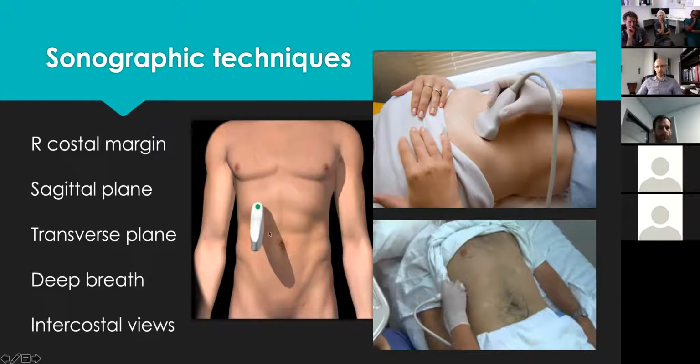Usually the way we get the image, we start with the patient supine or lateral decubitus with the ultrasound probe, usually the curve probe for better penetration and depth. Usually the gallbladder is in the mid-clavicular line, and if we rotate the probe a little bit counterclockwise so that the marker is towards the right shoulder, it's usually aligned with the long axis of the gallbladder.